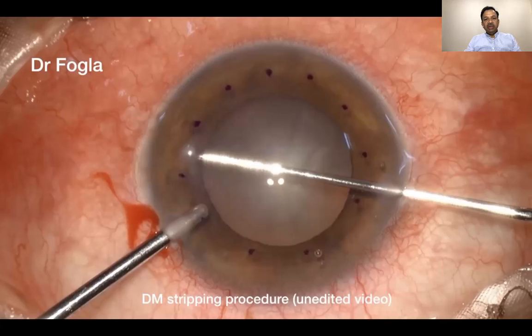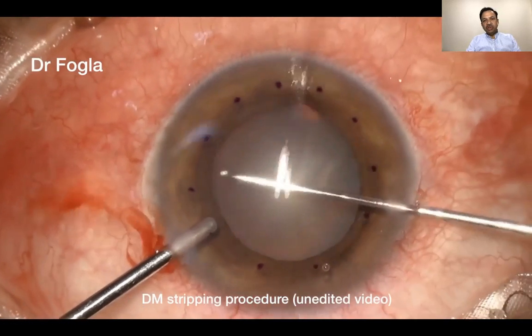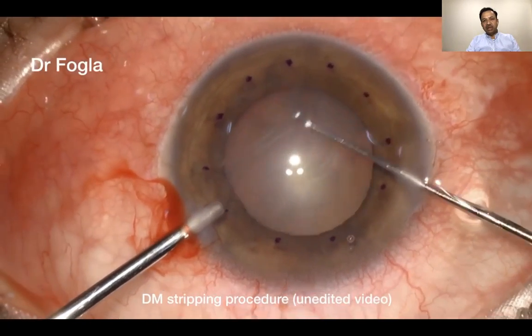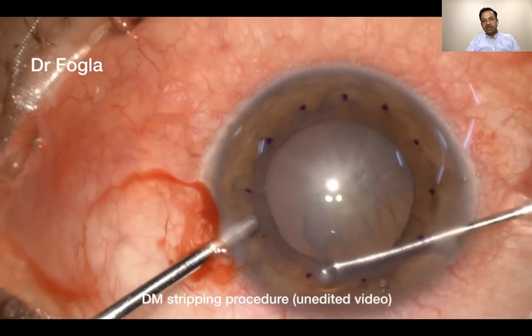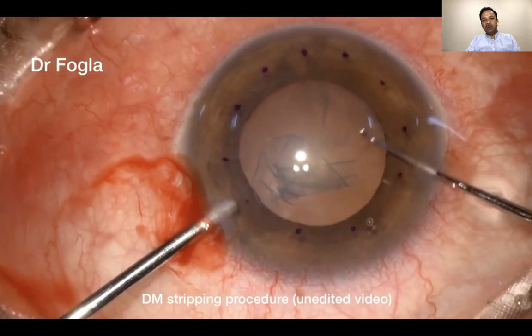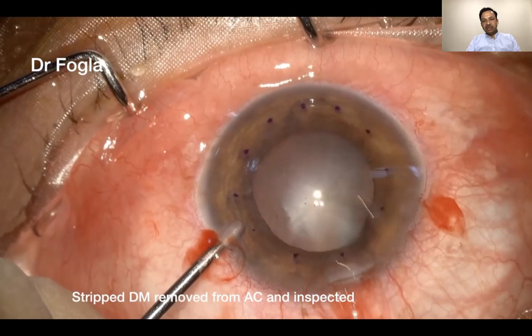But before we do that, you have to strip the host Descemet's membrane. So here you can see, under cohesive viscoelastic cover, we are using a reverse Sinskey or a specific DM stripping hook to break the Descemet's membrane at about 1 millimeter diameter larger than the size of the graft. And then you can strip the Descemet's away from its attachment.